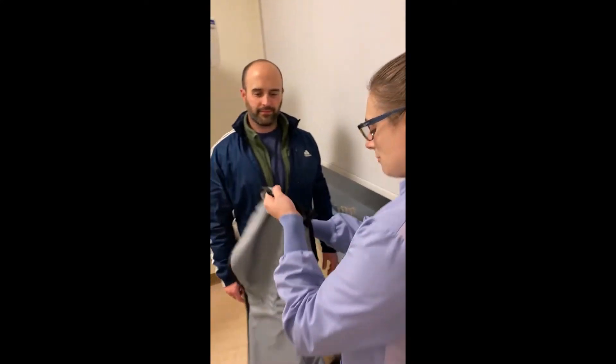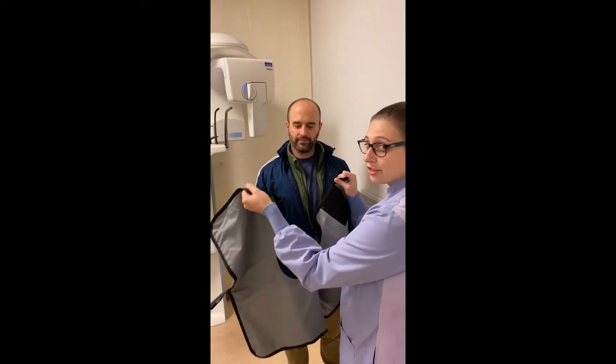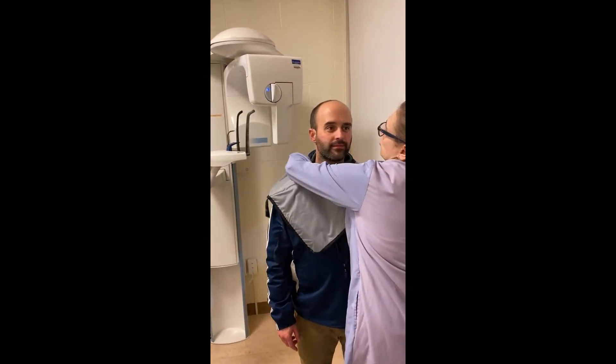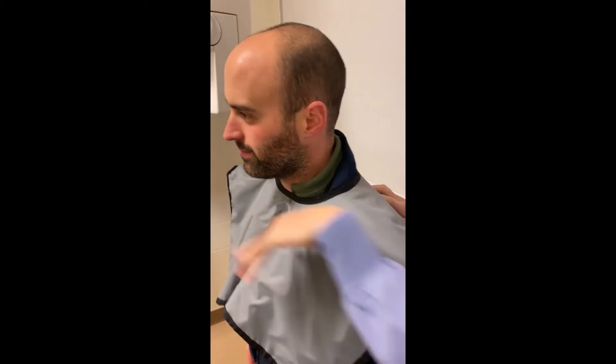Next, go ahead and put the lead apron on the patient. When we take the panorex, we are not going to use the thyroid collar, so we are going to drape the apron right across the patient's shoulders.